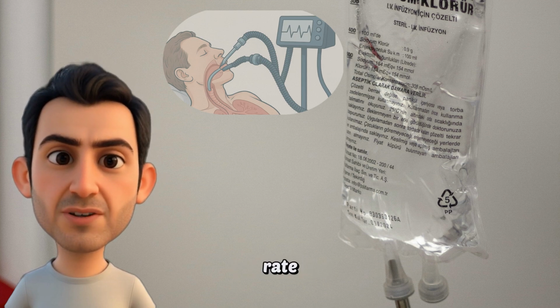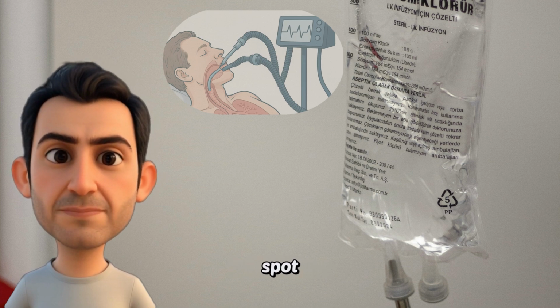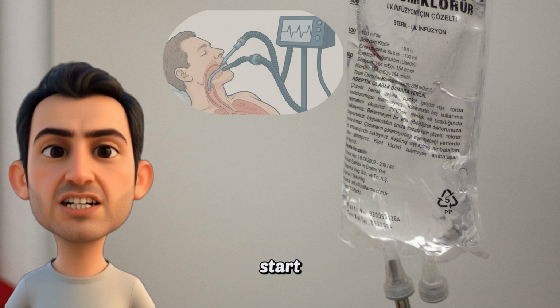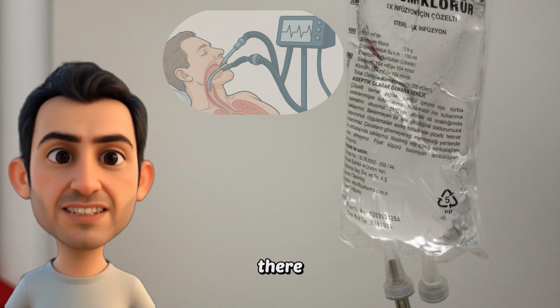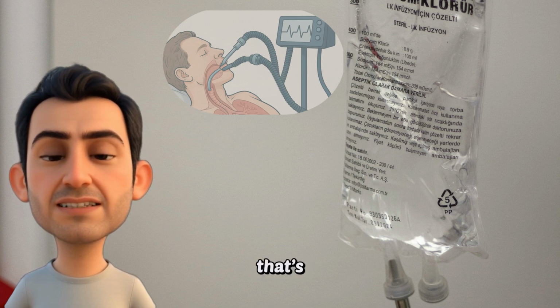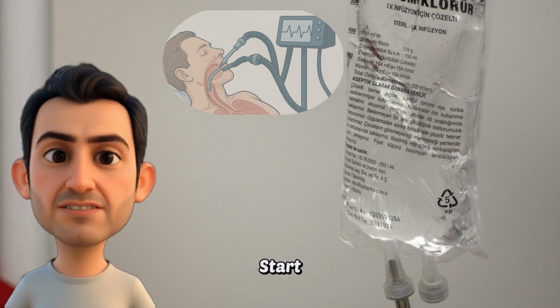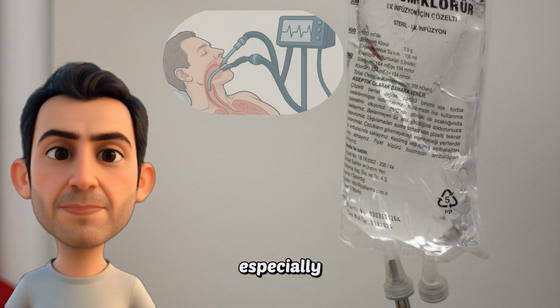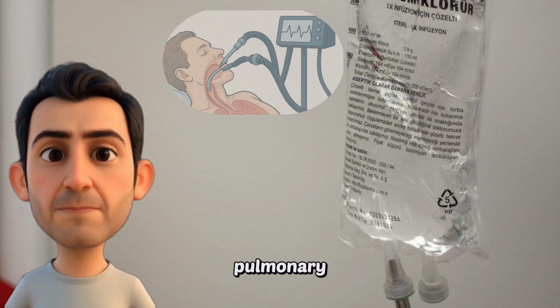Next, respiratory rate. 16 to 22 is your sweet spot. Go higher if your patient's hypercapnic. FiO2. Always start at 100%, but don't leave it there. Titrate down quickly to avoid oxygen toxicity. PEEP. That's positive end expiratory pressure. Start at 5, maybe go to 10. It helps keep the alveoli open, especially in conditions like pneumonia or pulmonary edema.